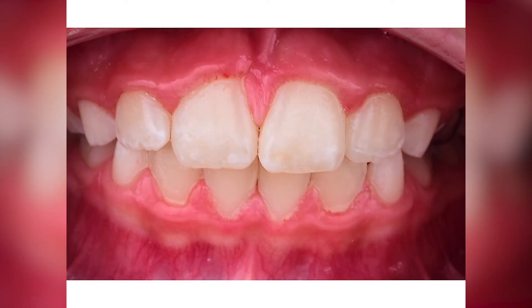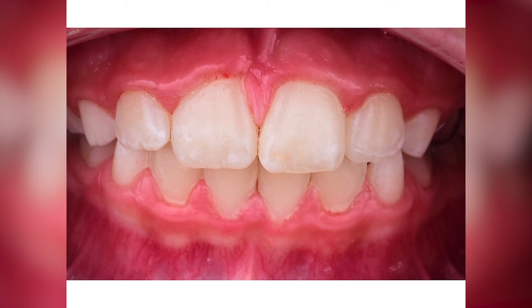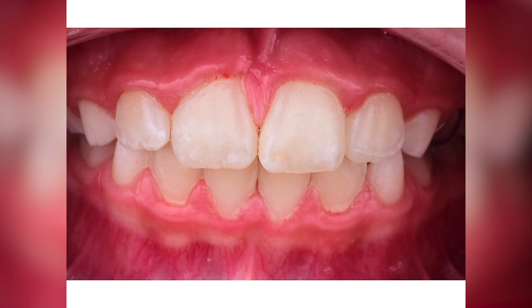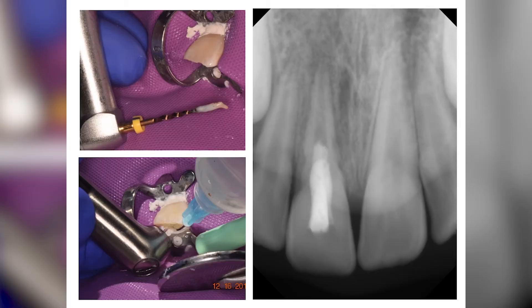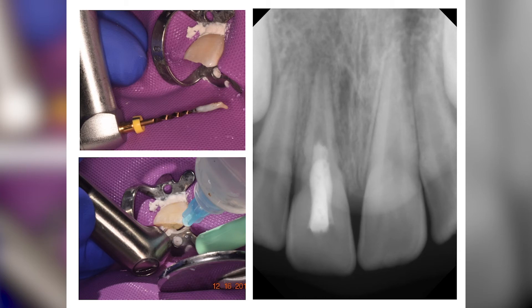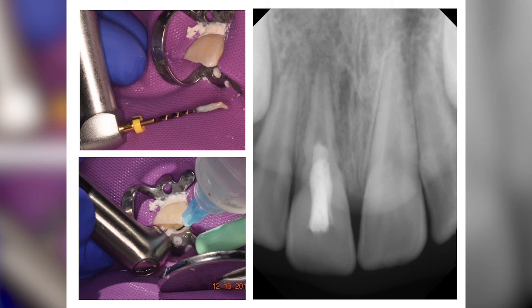The patient presented a few weeks later to the clinic for endodontic evaluation and treatment. The soft tissue appeared to be healing within normal limits. Diagnosis was confirmed of a necrotic pulp and asymptomatic apical periodontitis. Root canal therapy was initiated, necrotic pulp tissue was removed from the canal, and laser-activated irrigation was used to disinfect the root canal system.